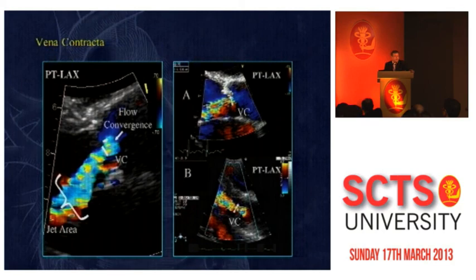So in eccentric jets, like in this one, you see there is a prolapse there. The orifice is located here, but it's not parallel to the plane of the aortic annulus. So you have to adapt your cutting plane to be able to see the orifice from an en face view. And you can do that in several different situations. For instance, in a patient with type 1 dysfunction, so mainly dilatation of the ascending aorta, you see here that the sinotubular junction has vanished. And then in this case, the jet was central, and we could make that cut very parallel to the plane of the aortic annulus. And then you freeze in diastole, and you can make the planimetry very easily of that regurgitant orifice.